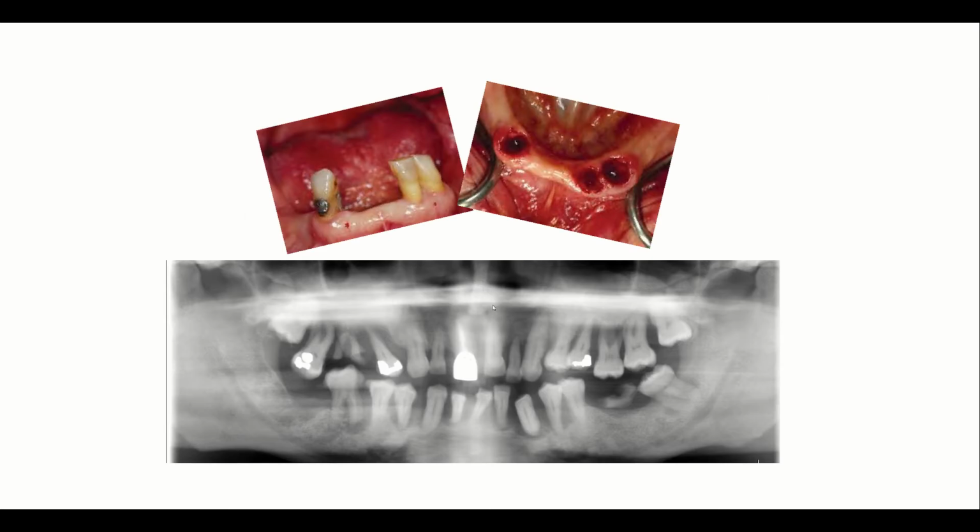Okay, as you can see here at the very top, we have a patient that only has a couple of teeth remaining. They've had other teeth extracted a long time ago. Areas are very healed, and you can notice here on the back left side that the bone has really resorbed. So those teeth have been missing for quite a while. So these teeth here are going to be very easy to get out, and you can see once they've been extracted what the remaining sockets look like.